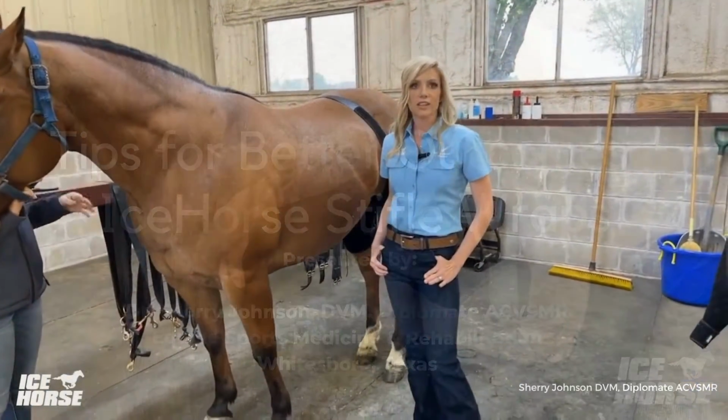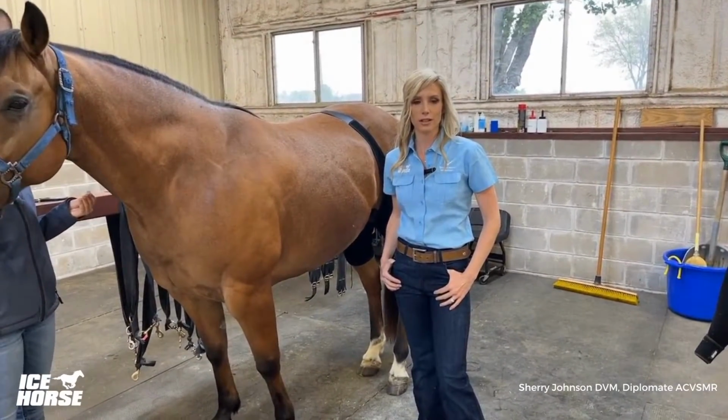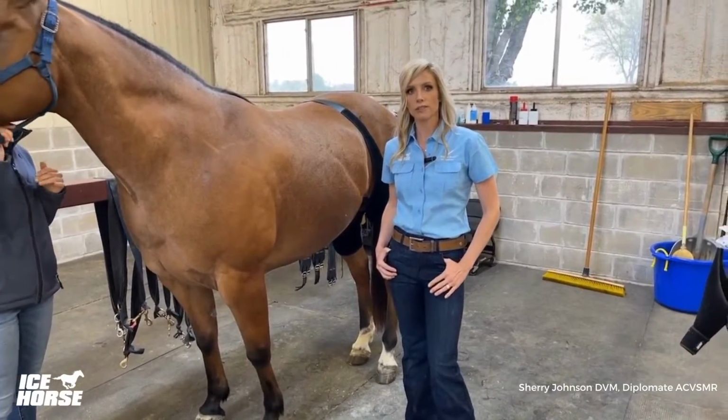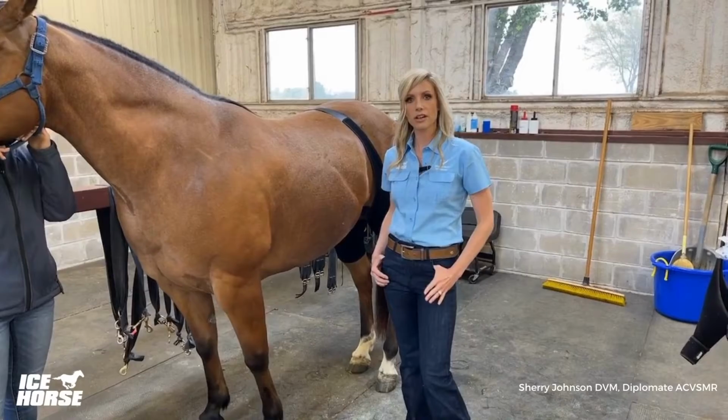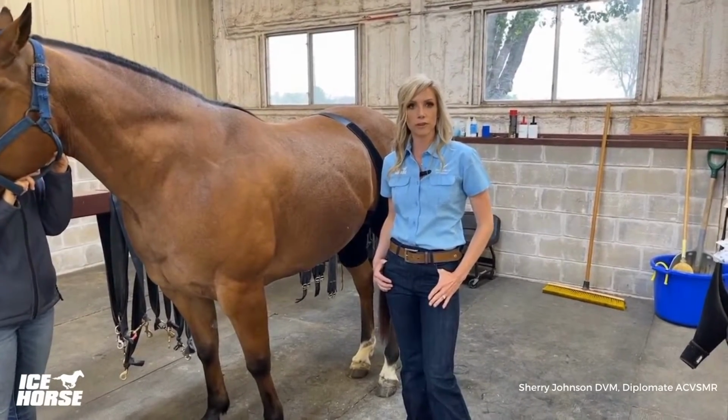Today, I'd like to discuss with you some pro tips and tricks for icing stifles in the equine athlete. Now, cryotherapy plays a major role in a lot of my rehab programs, and the thing I'm using it for mostly is pain modulation or helping the athletes feel more comfortable.